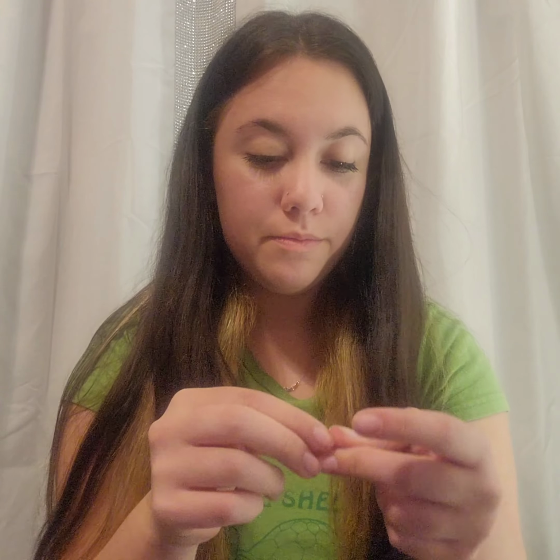The one I'm using is a size 1.5 metric and it's 17 millimeters, and then the needle itself is 75 centimeters. Sorry, they have them a little out of order on there.